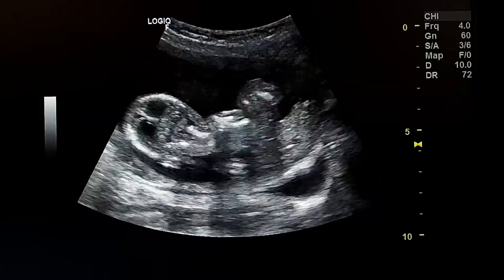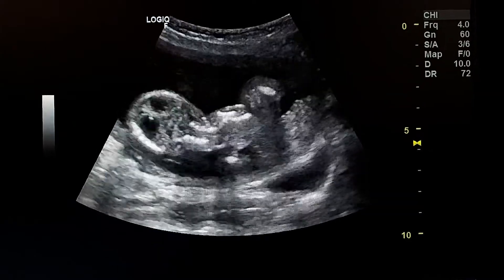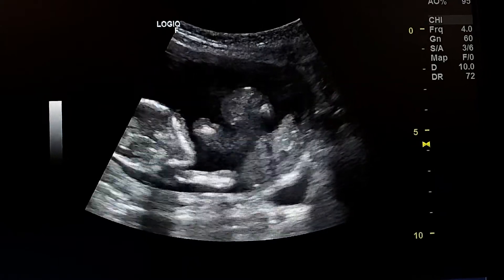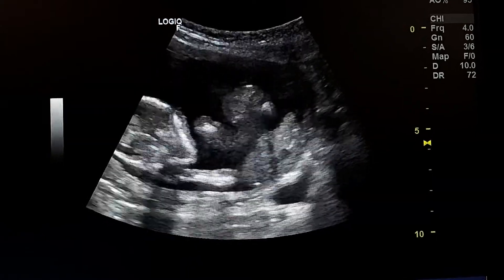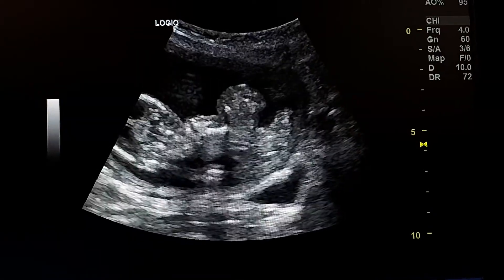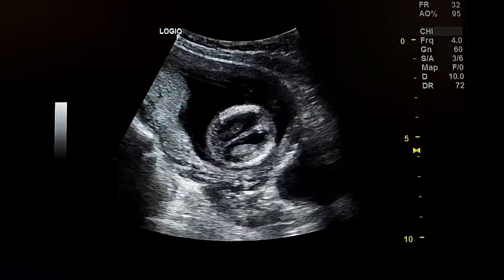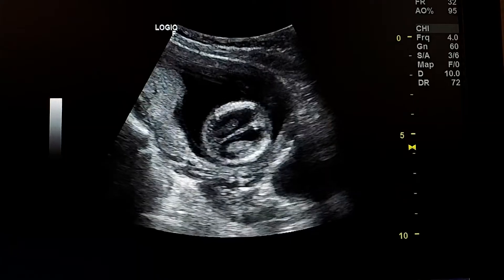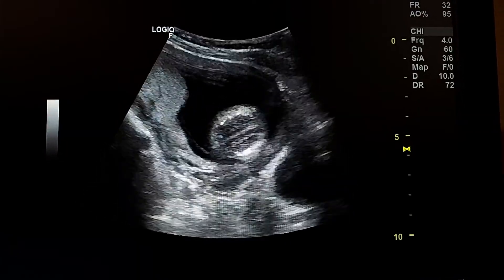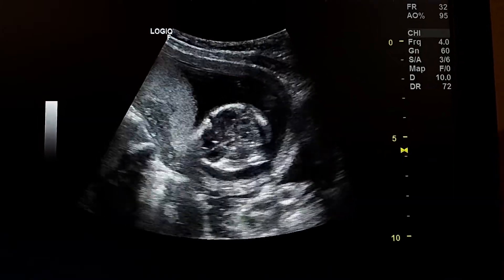This is an ultrasound case of a very rare anomaly in a fetus at about 16 weeks. The fetus has body stalk anomaly (BSA), which is a severe lethal anomaly resulting from failure of formation of the body stalk, with multiple malformations occurring at the thorax wall, abdominal wall, craniofacial region, spine, and extremities.